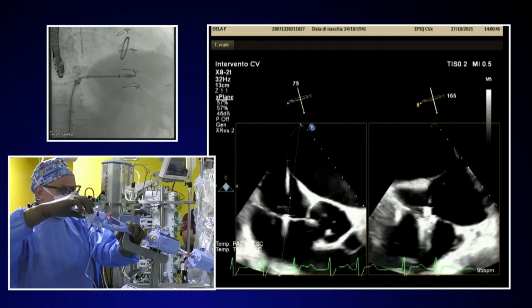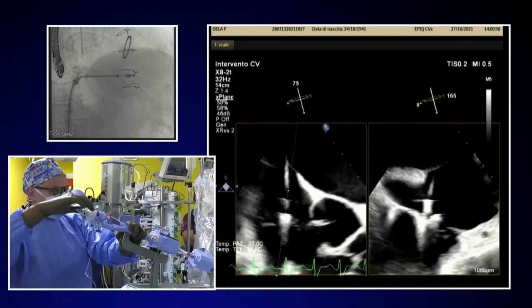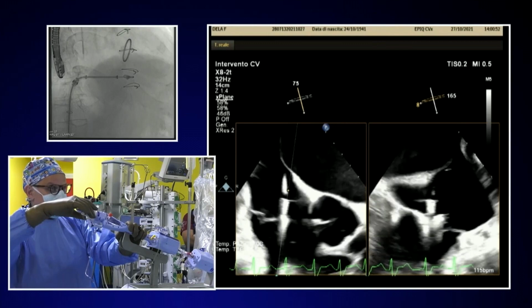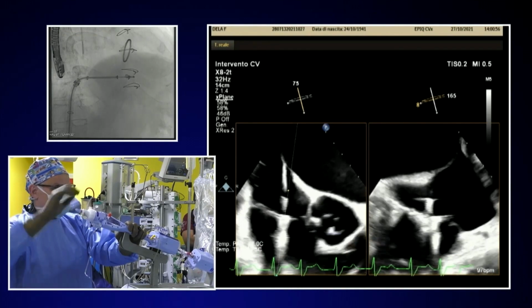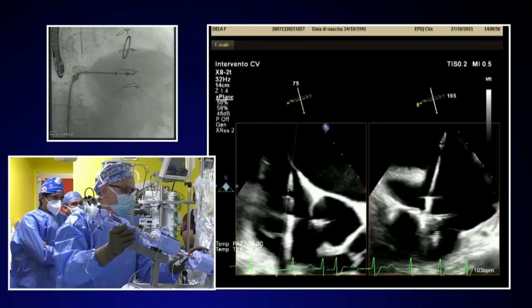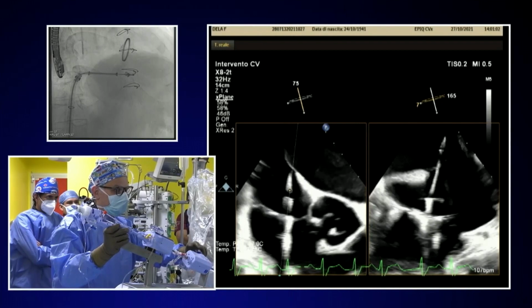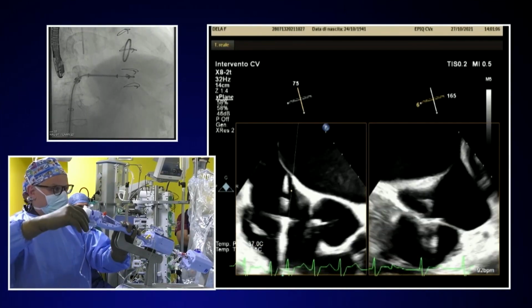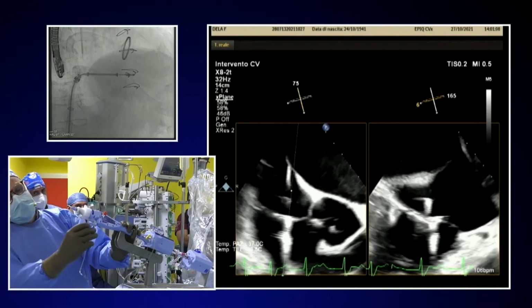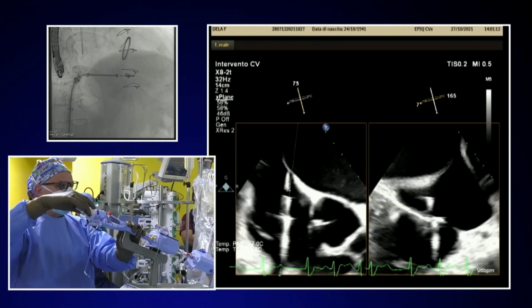can probably improve the anterior. Let me try. Let's open. Yeah, open with the gripper down. I think I should go a bit more lateral to change the angle and get more anterior if possible. I will open now selectively the anterior, this one. Yes, the anterior gripper is up.